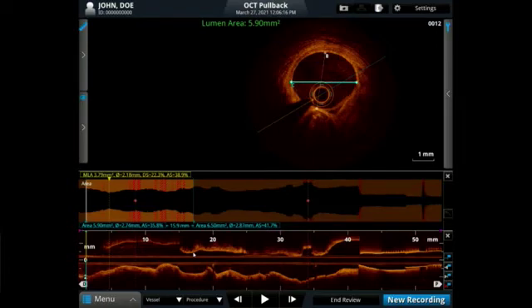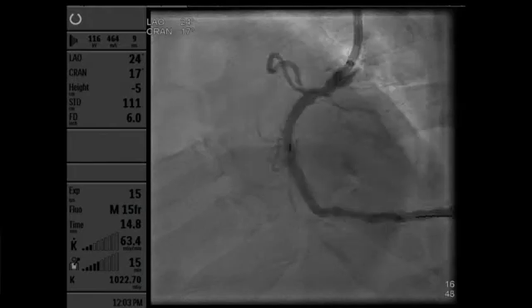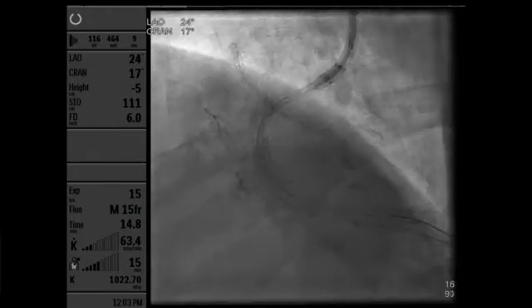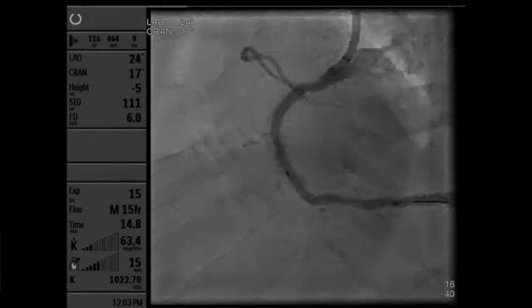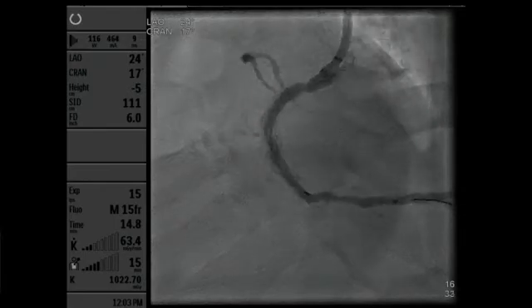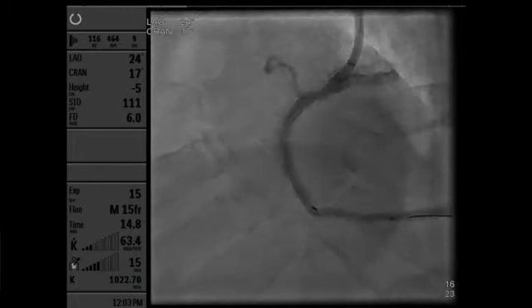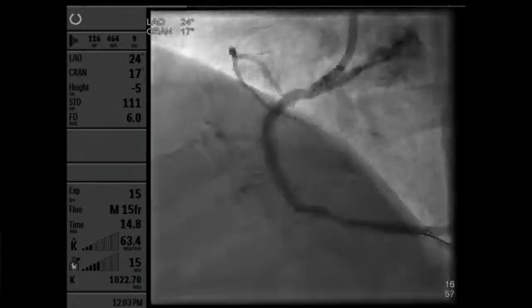So if you can show us angio, we'll see what you're doing now. Yes. So I'm just waiting for the stent to arrive, and then the stent is here. Go to live fluoro, please, and show us one angio of this post. Yeah, sure. So this was the OCT run, so that's why I kind of save on contrast when I do OCT. It's one-stop shopping. So this is your angio, and you could definitely see that the lesion is almost gone on angiography, at least in this view, which was the view that demonstrated the tightest area. Remember, your RAO was a bit better, but the LAO was bad. You also see the ridge and the rigidity in the proximal segment. Let's see how that goes.